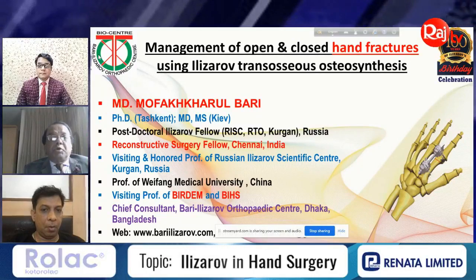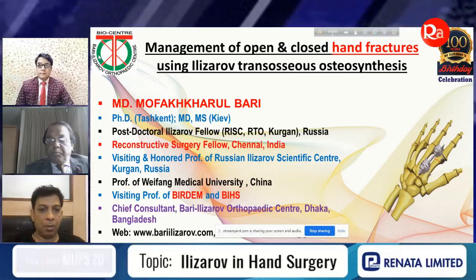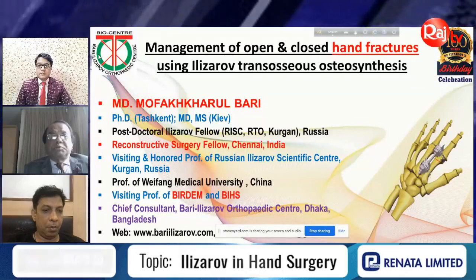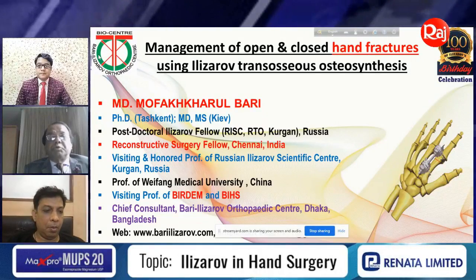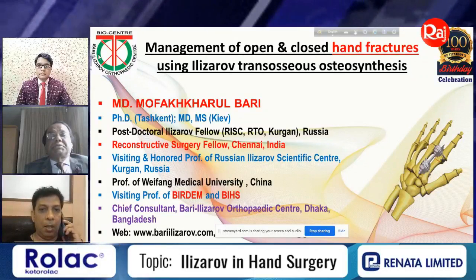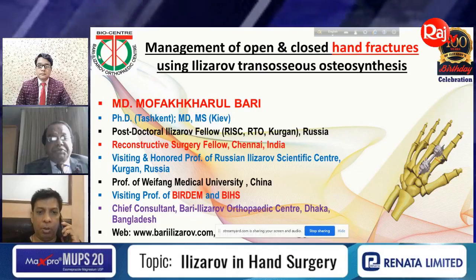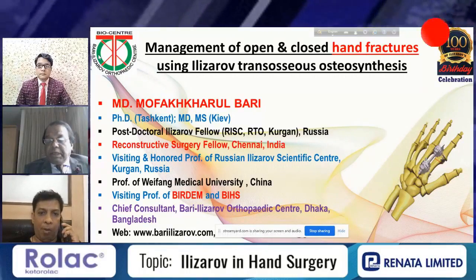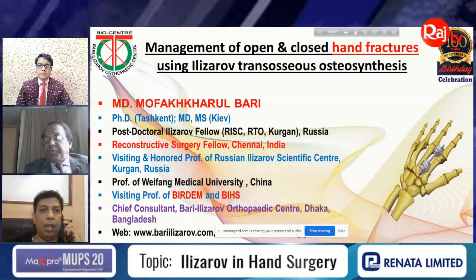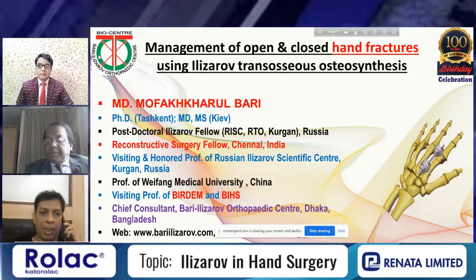Today I'm going to talk on a very important chapter. I'll talk on the management of open and closed hand fractures using transosseous osteosynthesis. Here, transosseous means I'll use only the wires, no pins. Whenever we are talking regarding the hand, it starts from the shoulder up to the fingers, phalanges. And today I will talk only on the wrist and the hand.